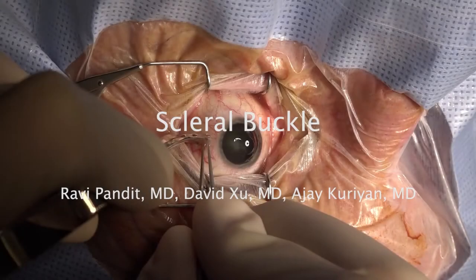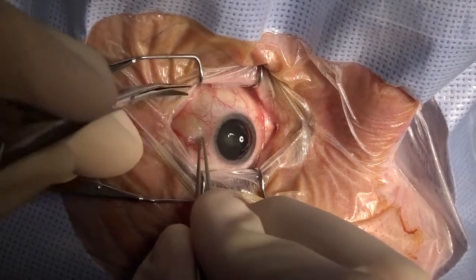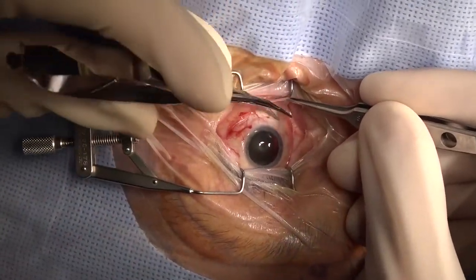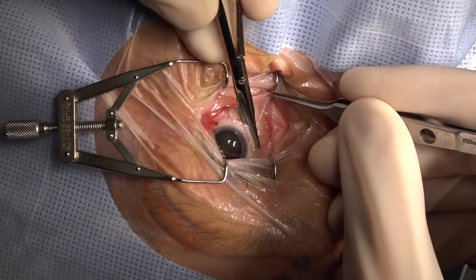Hi, we're going to demonstrate the procedure for placing a scleral buckle. This patient is getting a scleral buckle in combination with a vitrectomy. The first step is to make a 360 degree peritomy. We're leaving a few millimeters from the limbus in order to give the patient more comfort after surgery.